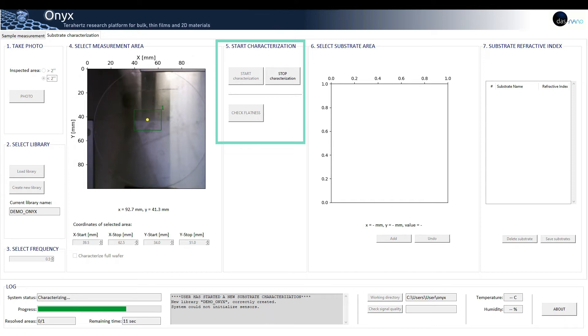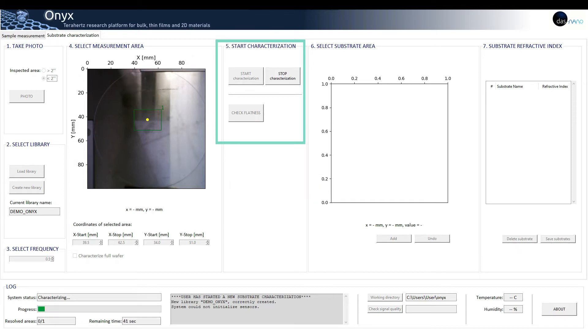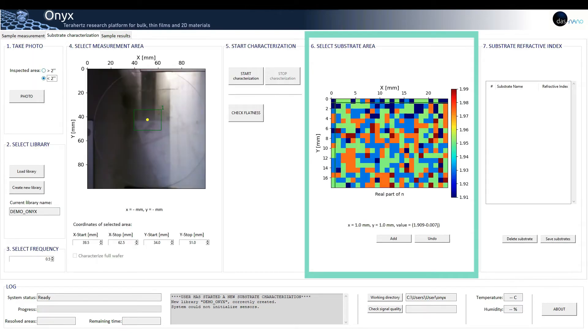The sample flatness can also be checked using the check flatness button. Six: select substrate area. Once the measurement has been performed, a refractive index map of the substrate will be represented.